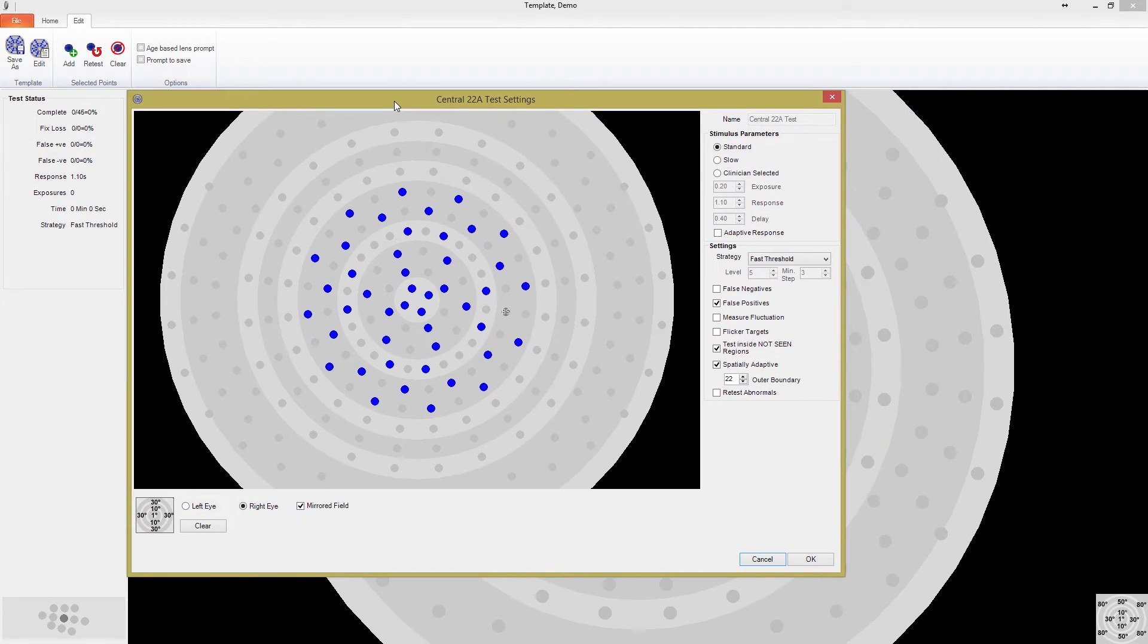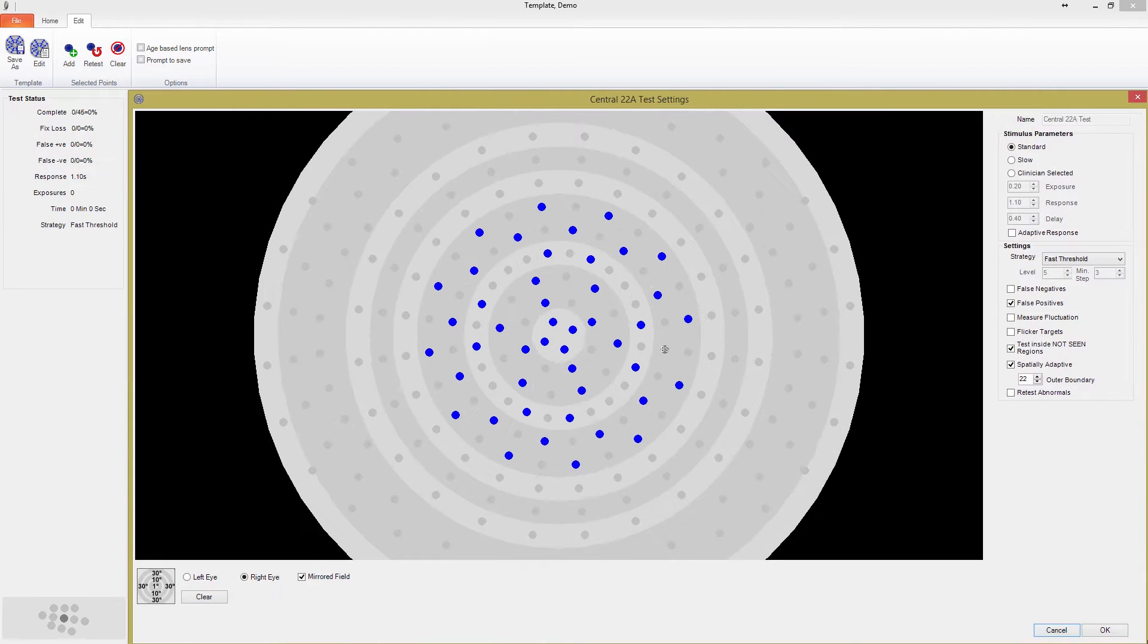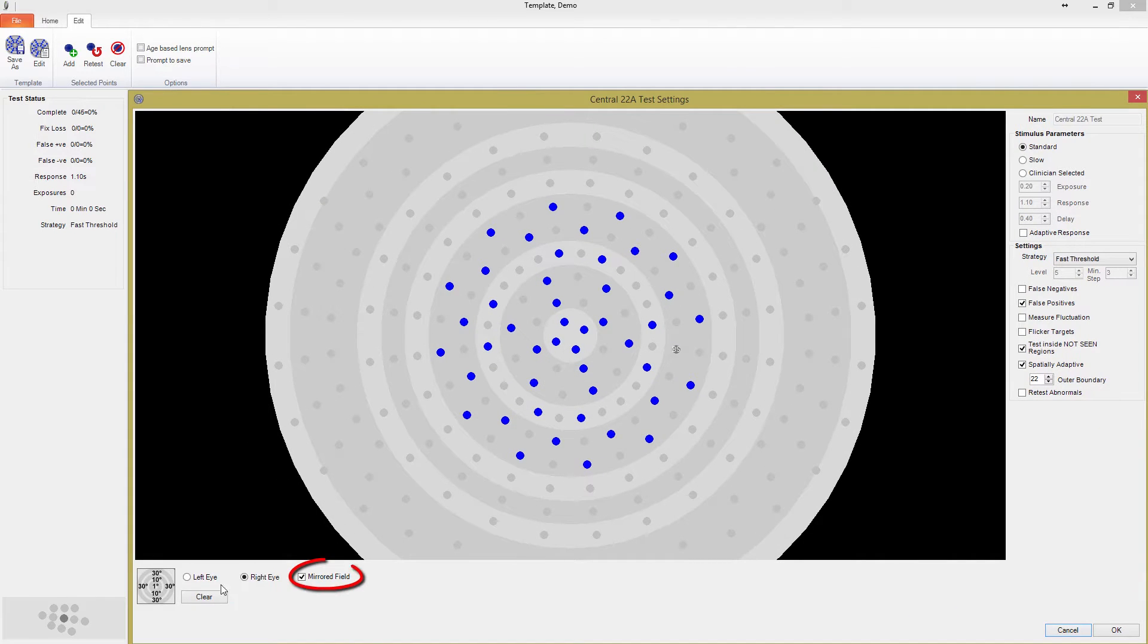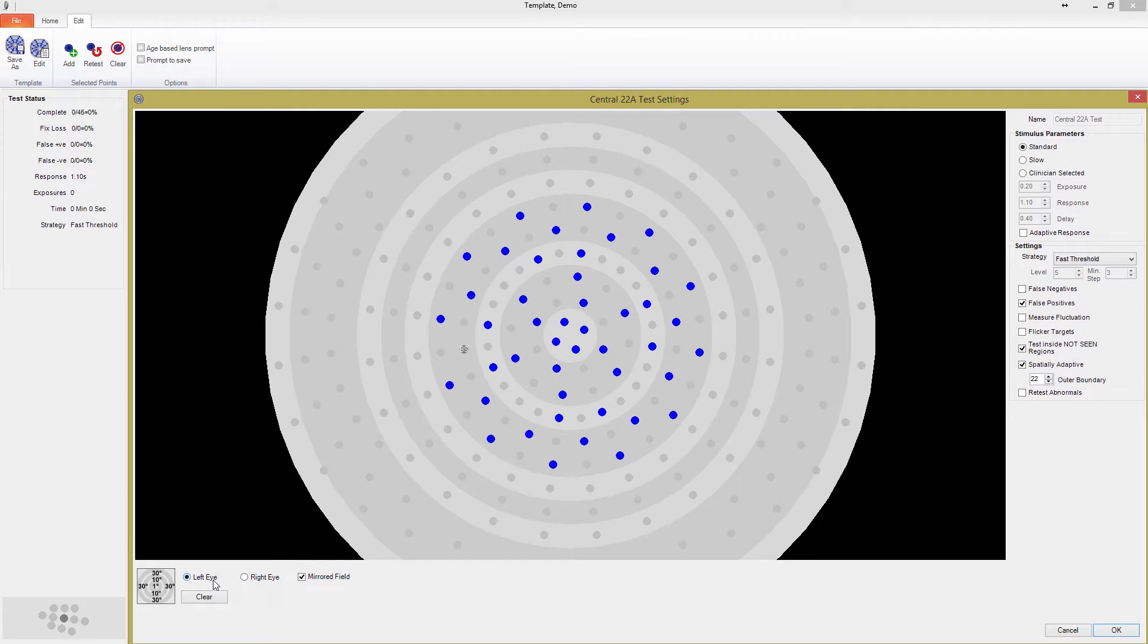Before you start editing the stimulus locations, make sure you understand the mirrored field checkbox. Test templates are saved as eye-specific. With the mirrored field box checked, any changes made in one eye will be mirrored in the other eye.